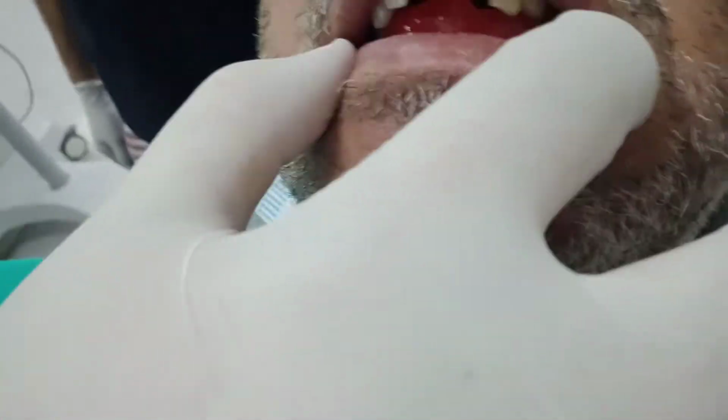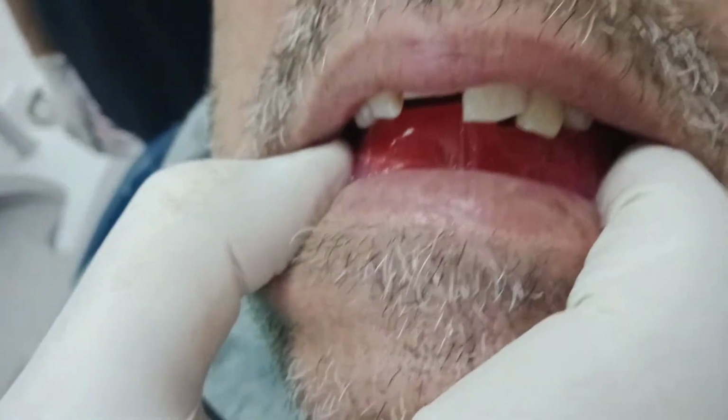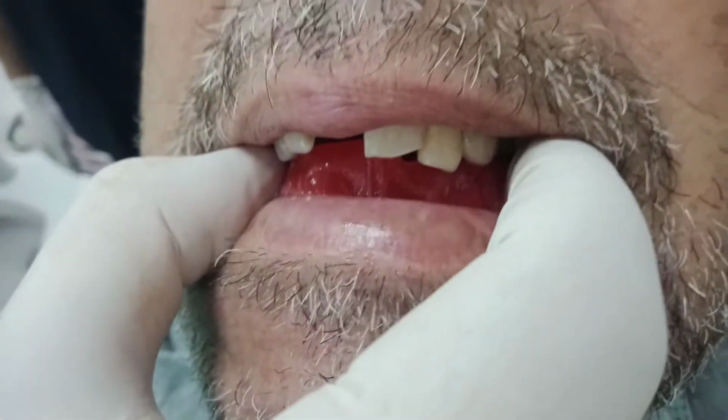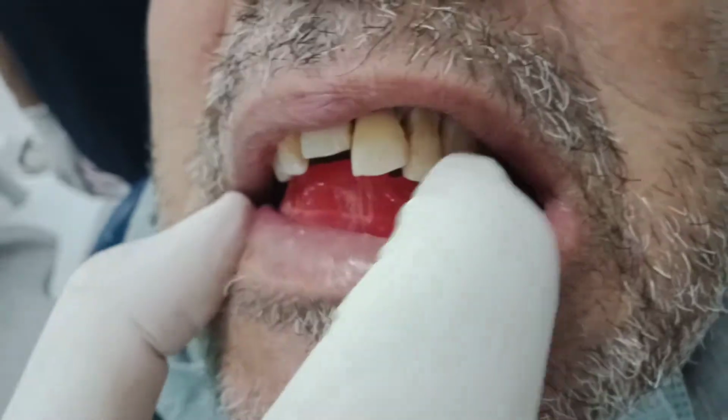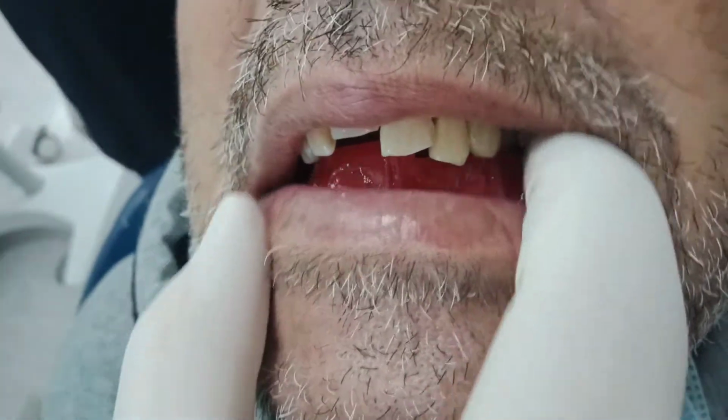So my question for the student, and why I'm doing this video, is I was asking the student, what are you going to do to take the bite? So this is the RCP of the patient. We have avoided the over-erupted teeth by placing indentation in the wax. We have checked the freeway space while the patient was speaking.